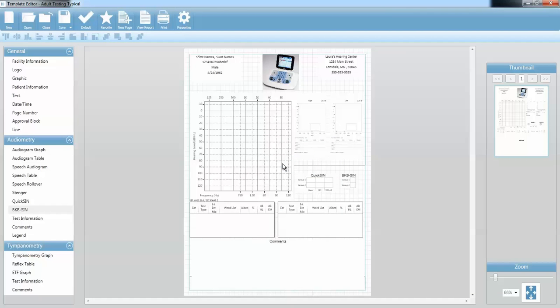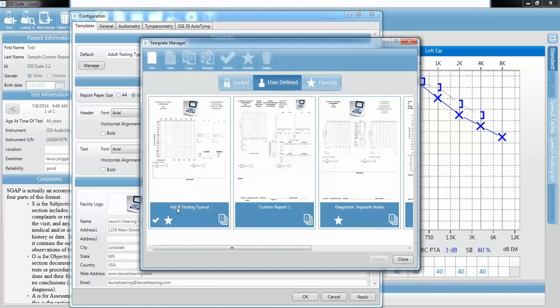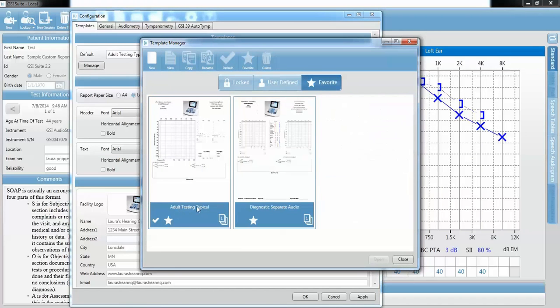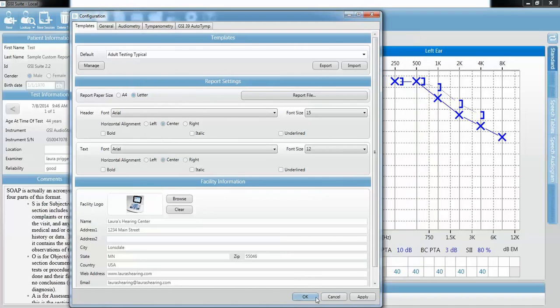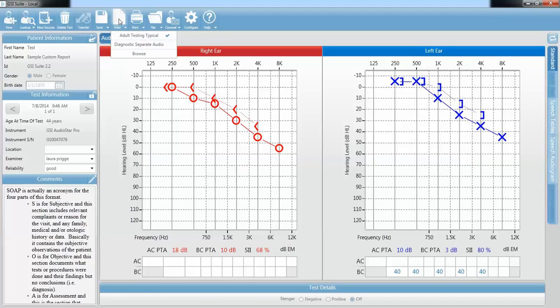When I am satisfied with the way that my report looks, I'm going to press Save to save the template. I'm going to save the template under a name I'll remember — we'll call this Adult Testing Typical — and press OK. It will save that report and then I'll get some more options. Because I've spent the time making my report the way most of my referral sources want to see it, I'm going to make that the default report. I'm also going to add it to my favorites. Now when I close and look at my Template Manager window, under User Defined I have my Adult Testing Typical. Under Favorites I have that same report — it is the default, indicated by a check mark, and a favorite. When you close the configuration screen, please always press Apply and then OK. Every time I'm ready to save, view, print, or save to a file my report, I can use the drop-down menu and it will list all of my favorite reports, with my default indicated by a check mark.